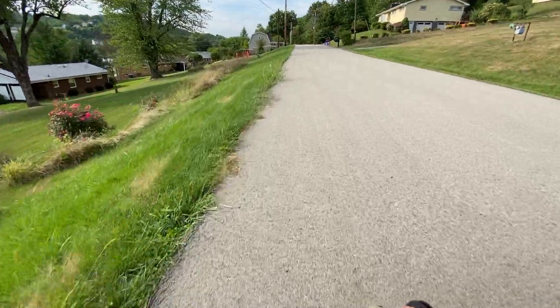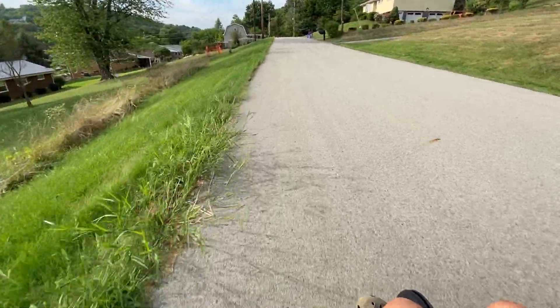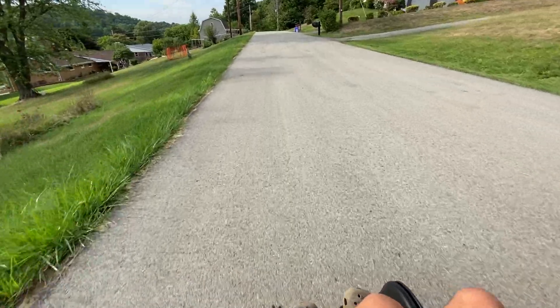You can see we cruise along at a nominal 6.5 to 7 miles an hour. This is a very fast power chair.